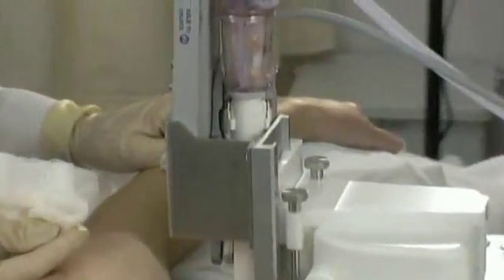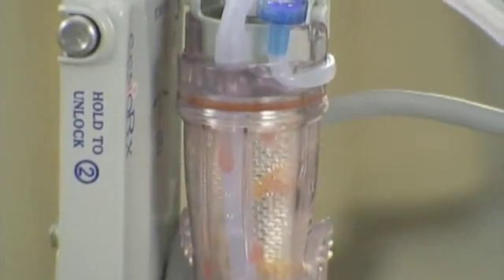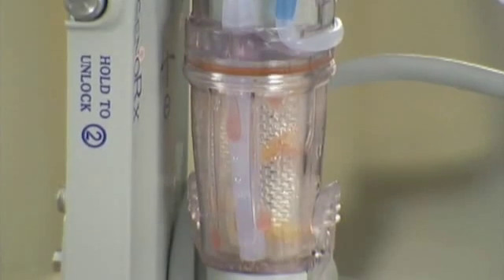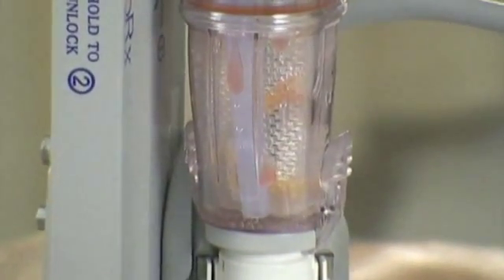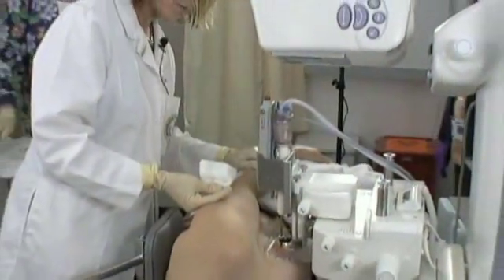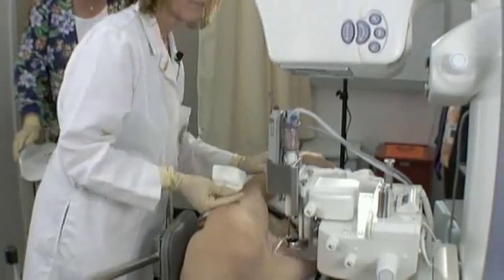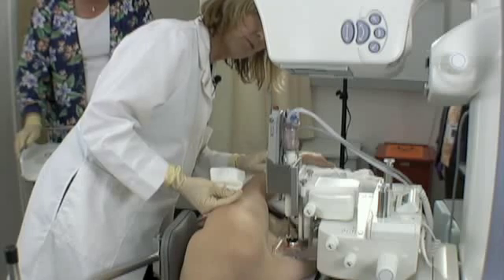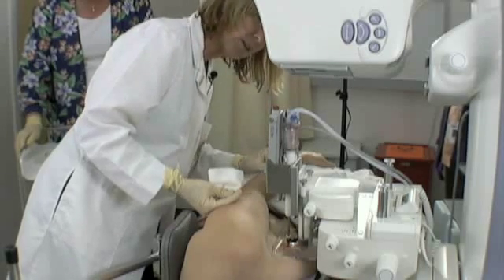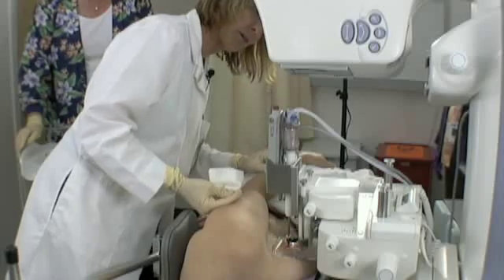The samples are washed as they're collected, and the effluent is taken away by another vacuum. What we're doing now is vacuuming the area where we've taken the samples. I always like to vacuum and make sure things are nice and clean — it gets rid of any tissue that may be in the chamber and also takes care of any heme that may be at the site.